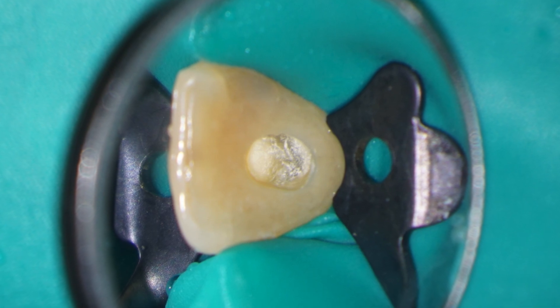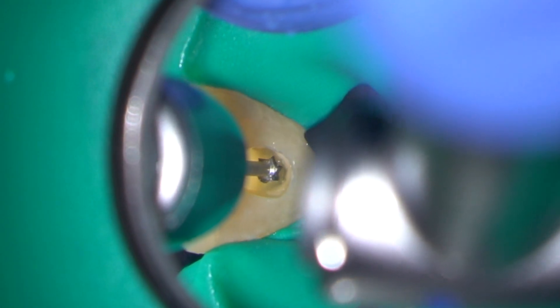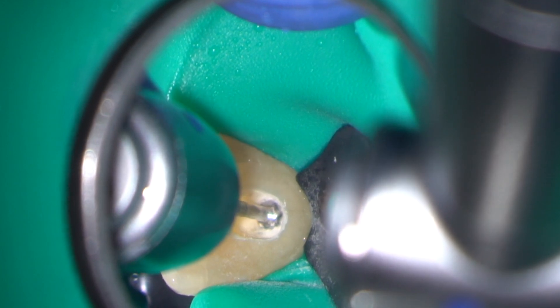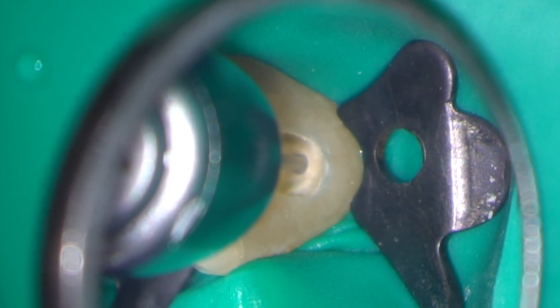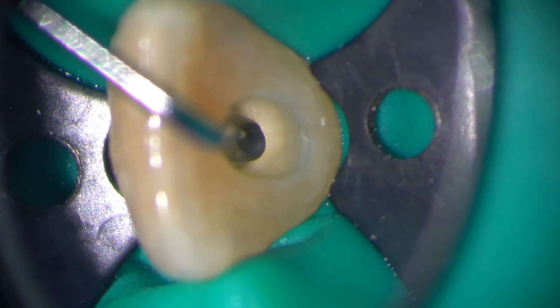Looking under high power you can see the dark area that is the sclerosed canal, and this is where we need to look for the root canal. In this case I used an LN burr to remove dentine where it was dark until I found a patent root canal. Under high magnification you can see the little white dot which is the patent root canal. I'm using an endo explorer just to open up the canal before flaring it with the ProTaper SX instrument.